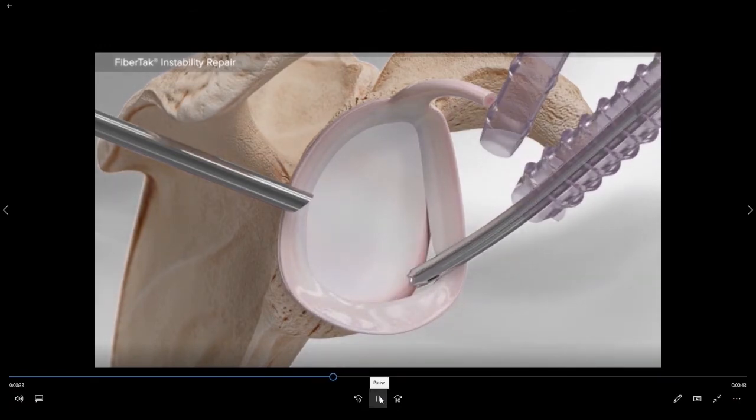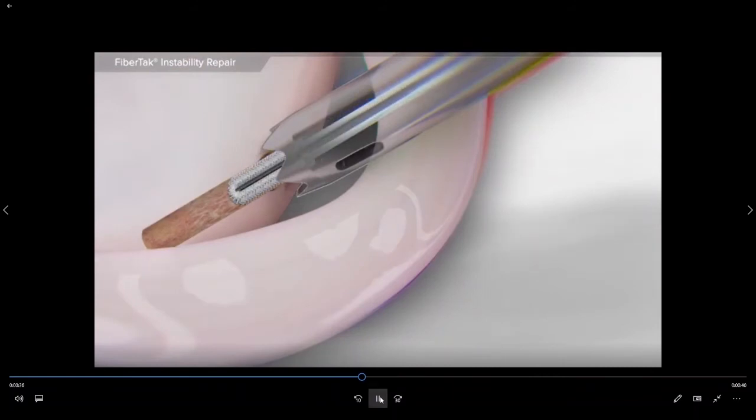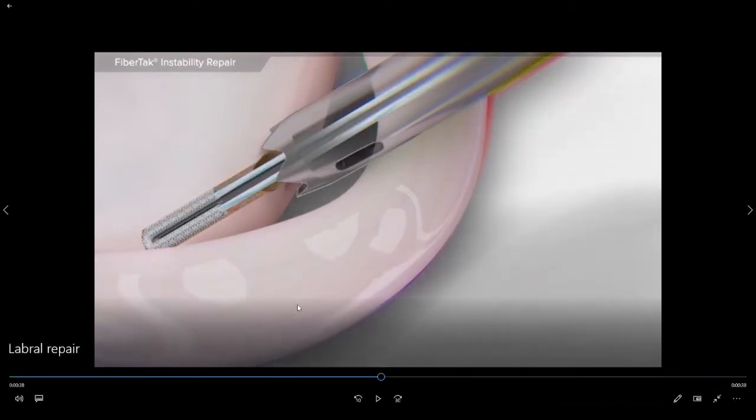We drill a 1.8 millimeter hole into the bone. After drilling the hole we place the implant. The implant is malleted into the bone and this is what we call an all suture implant meaning that there's no metal or plastic in this implant to keep this implant down and into the bone.